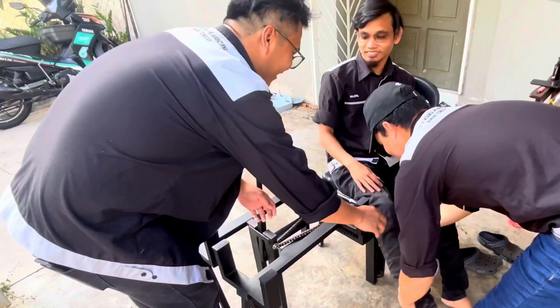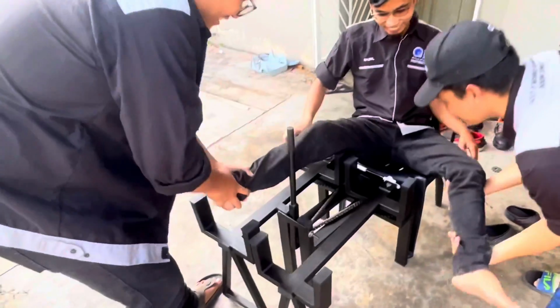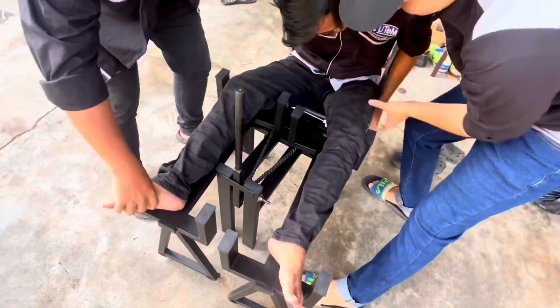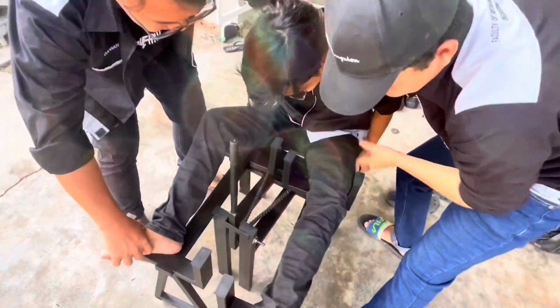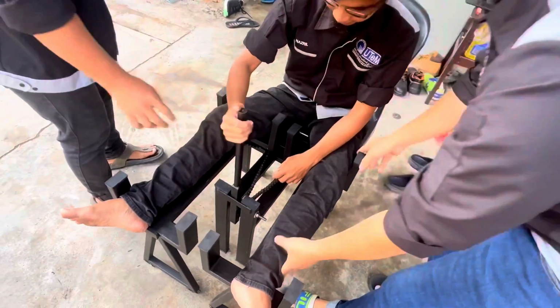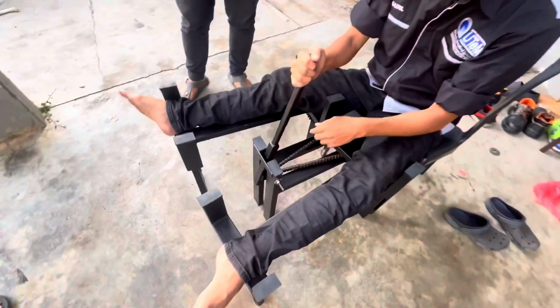Okay, this is the demonstration of how the male patient uses the assisting device. The physiotherapist can help the patient to sit on the chair if it is difficult for the patient to do it by himself. Okay, let's see how the mechanism looks like.